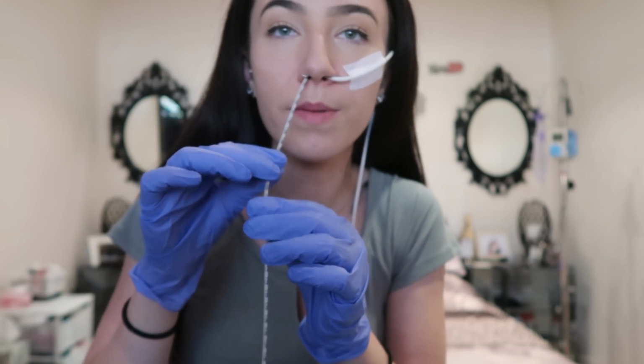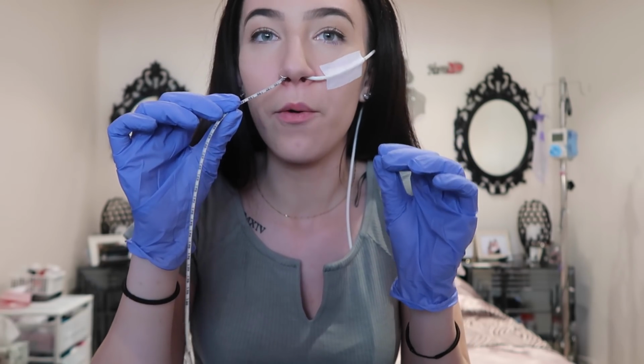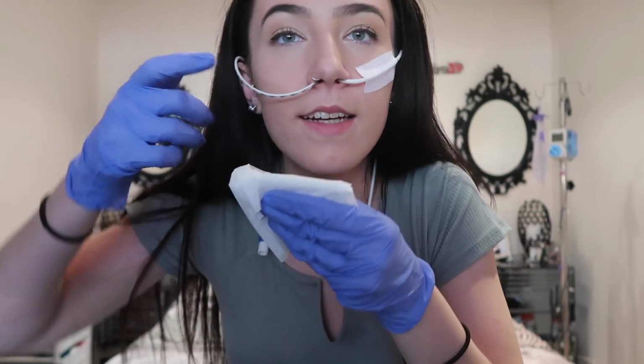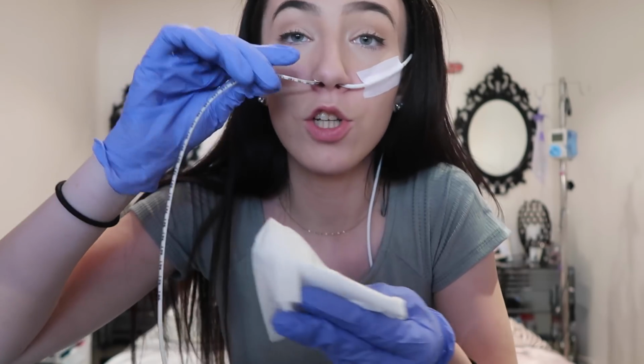Okay, so then what you're going to do is, I like to do it in one swift movement. So just kind of blow your nose right outwards, which I'm just going to quickly get a tissue for in case any stuff comes out, which it most likely will. It's always good to have a tissue box handy. You can hear my nose getting a bit nasally already because it's getting aggravated that the tube's wiggling around without the tape. So I'm just going to get this handy, and I'm just going to pull quickly. And I don't want to place the tube down if the surface isn't sterile.